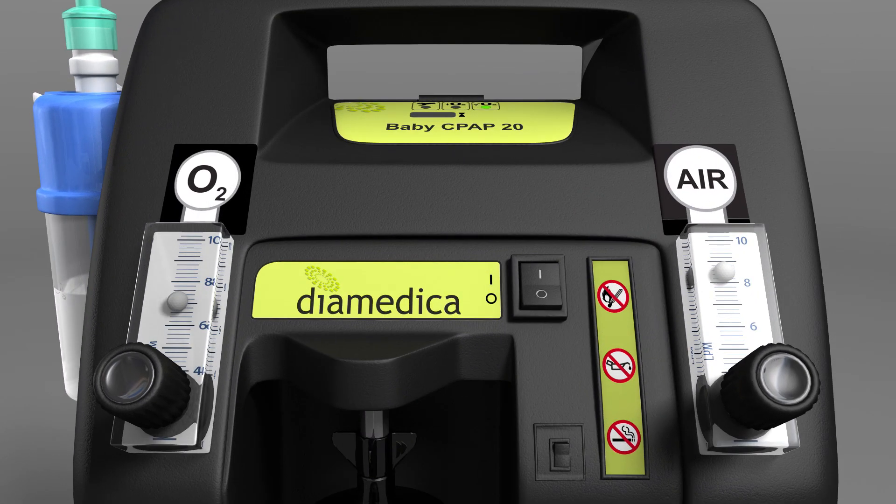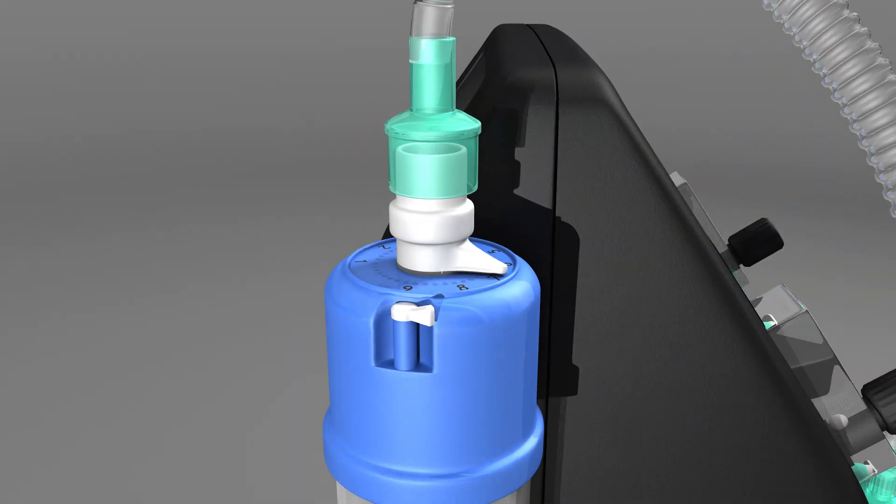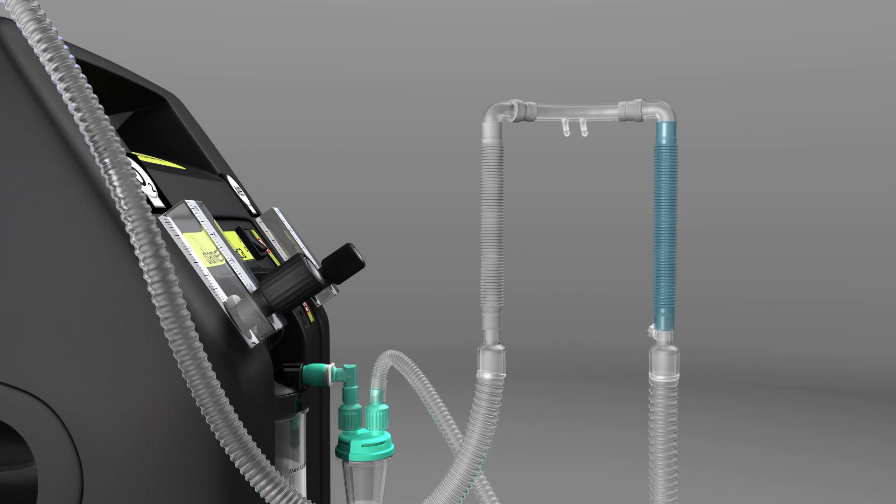Set the gas mixture to the desired flow rate and oxygen concentration using the flow meters. Set the CPAP pressure level using the dial on the bubble bottle. Fit the bonnet to the patient. Select the appropriate size of nasal cannula and connect to the inspiratory and expiratory tubing.